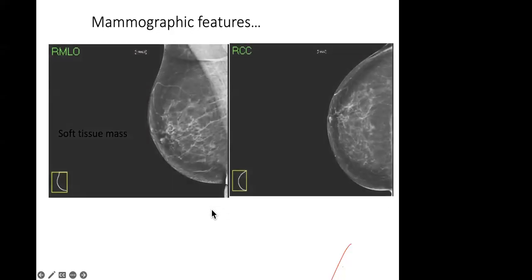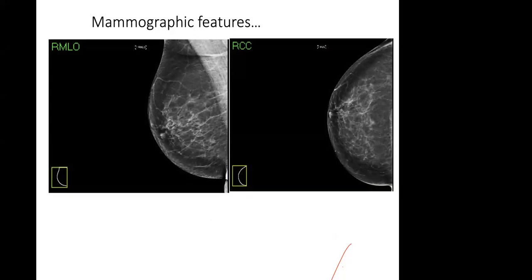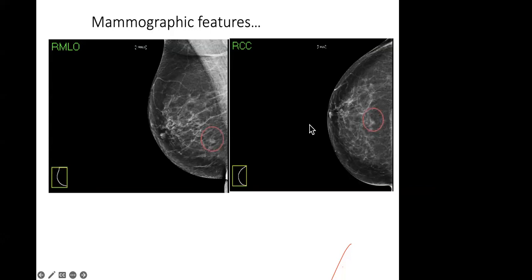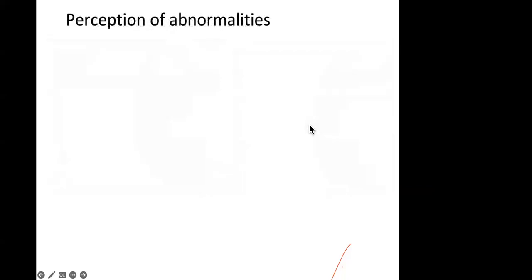Soft tissue masses on a mammogram can be very difficult to see, but you can begin to make out something. With good mammography positioning, you need to be careful not to get carried away — what may appear to be a mass near the nipple may actually be the nipple folded behind due to positioning. With time, you start differentiating, and it's another view that you're questioning.